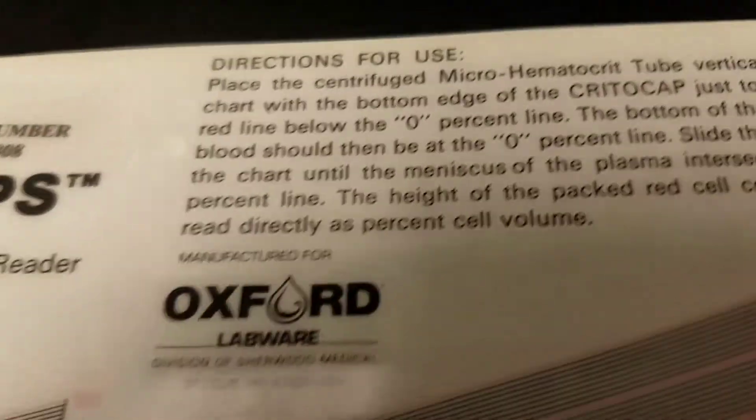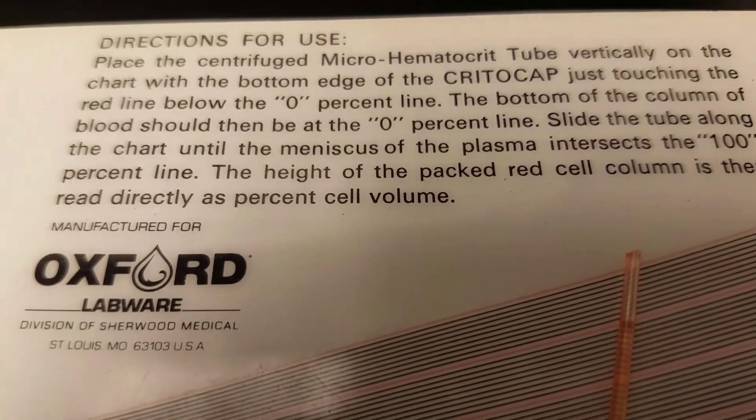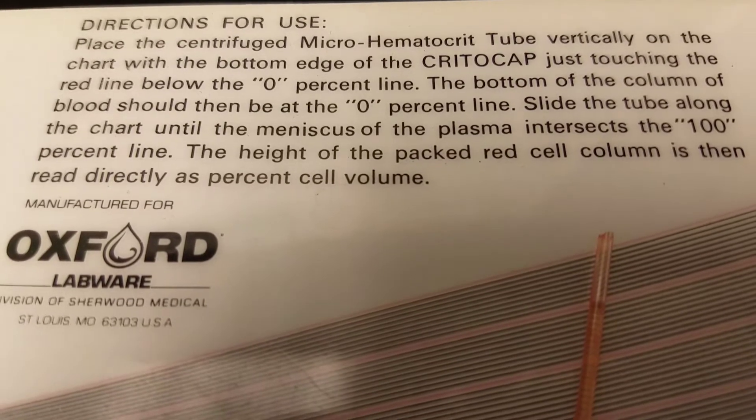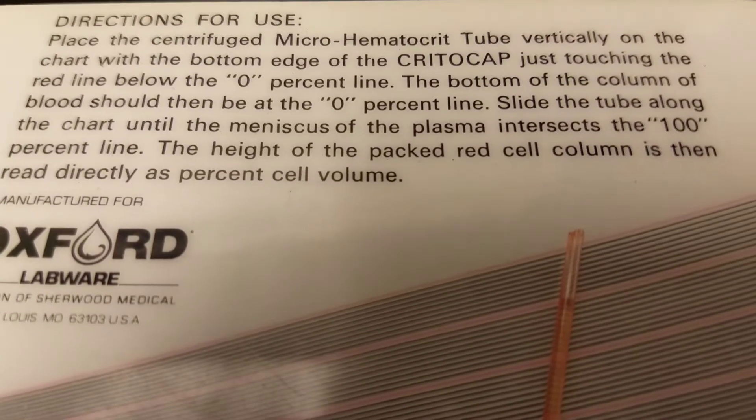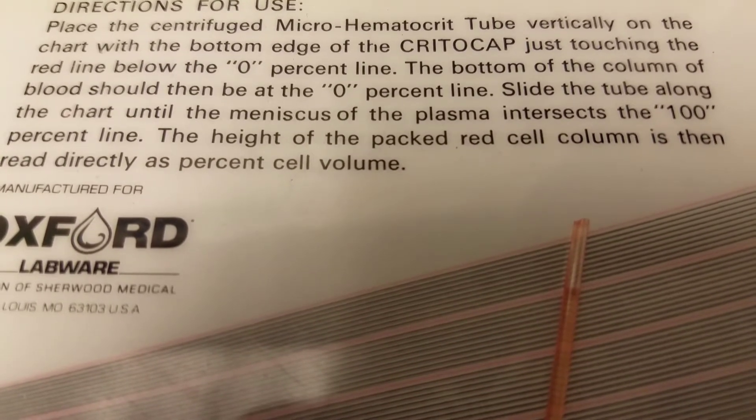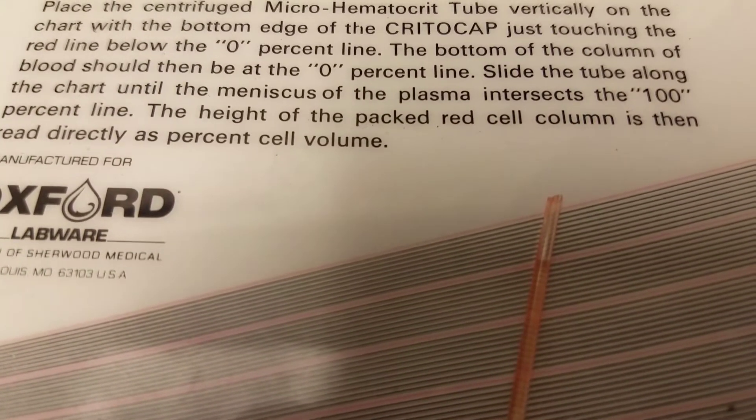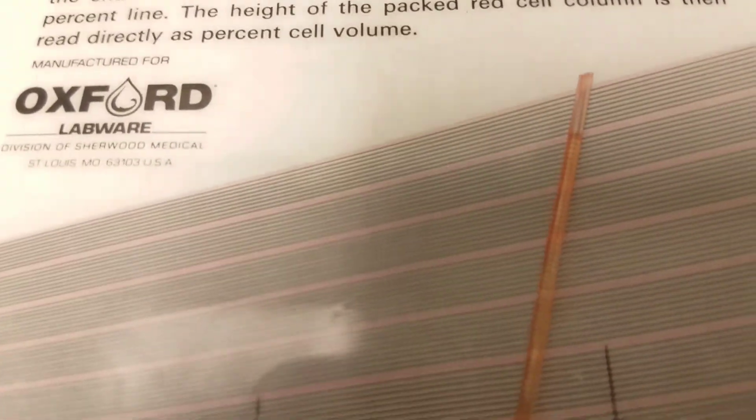Now here in our paper, what we have to do. It says here: place the centrifuge microhematocrit tube vertically on the chart with the bottom edge of the Critocap just touching the red line below the 0% line. The bottom of the column of the blood should be at the 0% line. Slide the tube along the chart until the meniscus of the plasma intersects 100% line. The height of the packed red cell column is then read directly as percent cell volume. We need the edge of the Critocap and that would be that little white part.